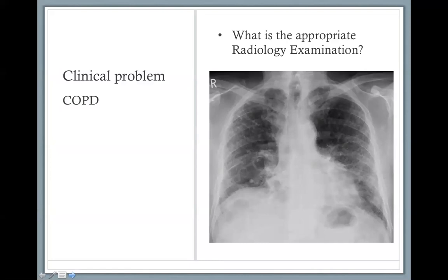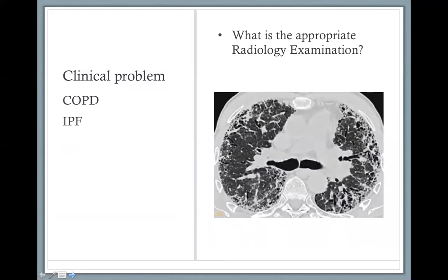So remember, this is a chronic problem and you don't really know what is the cause of the shortness of breath. Here you can see abnormality, which is reticulations. It's like very overlapping lines throughout the lungs. So this is reticulation. But the question is, is this patient having lung fibrosis? Is it emphysema? Well, we cannot tell very much. So in this case, I would say we can do a CT, and the CT shows us that he has lung fibrosis, right?